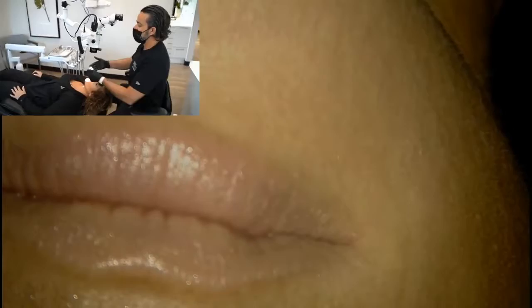So there's a working length here, the focal length from the patient to the microscope. And honestly, the farther you're up here, the more assistant space that you have. There's less constriction. And it also helps you keep your posture upright.